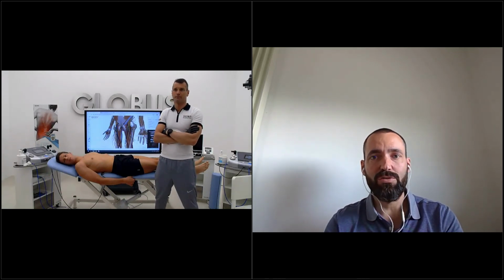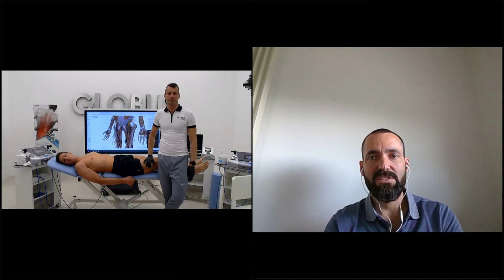But only if you are sure that we are already in a chronic phase, because with a big lesion like this, if you go deep with fascia tools or raise the temperature, you can have some hematoma or other problems. But the question was about the chronic phase, with already retraction, so in that case you can be a bit aggressive: fascia tools, fibrolysis, stretching, eccentric exercise.